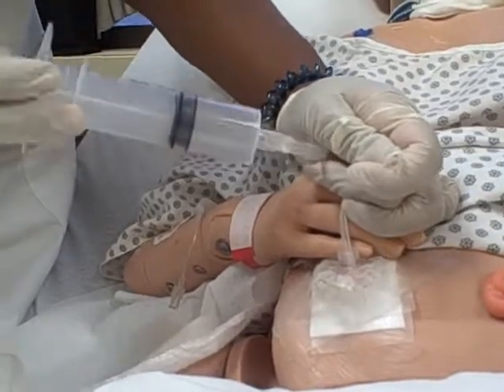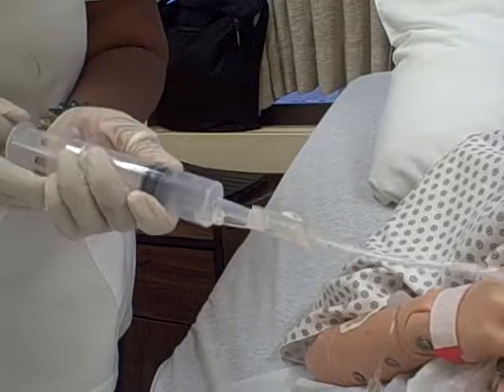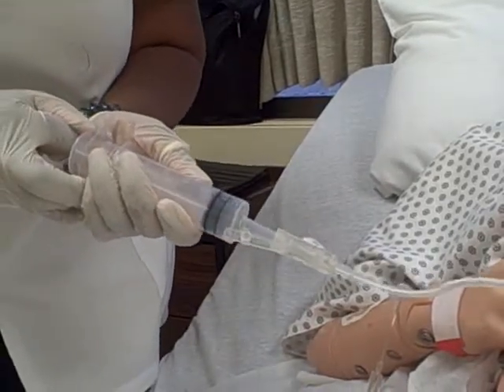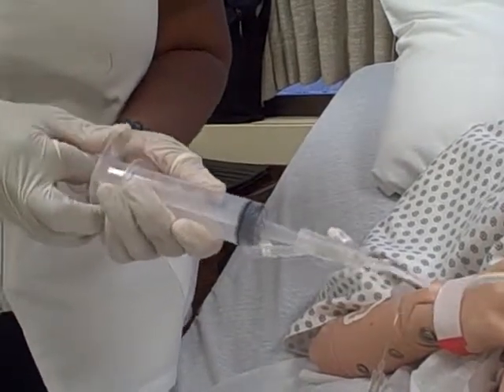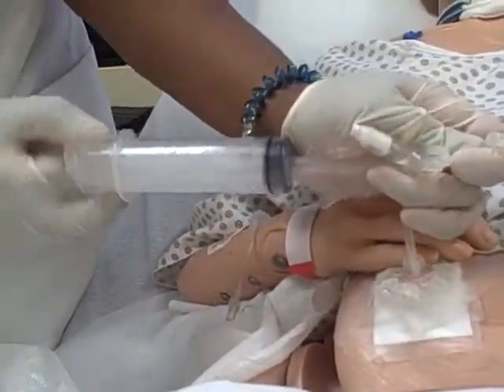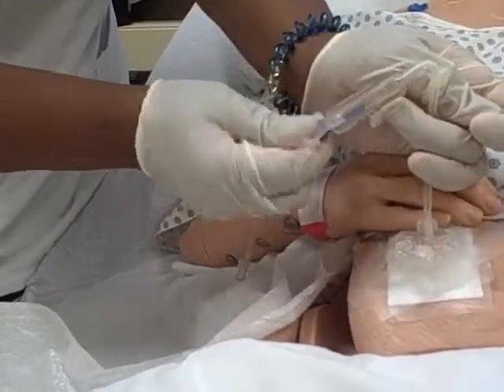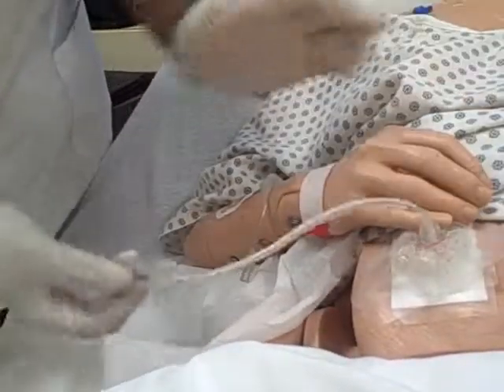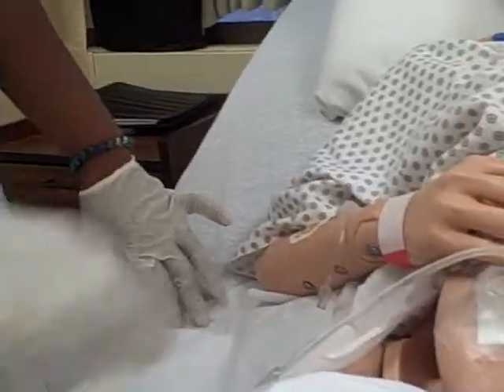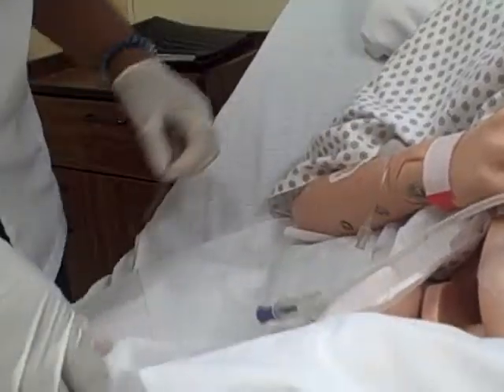And I want to unkink and irrigate the tube. Going to kink, remove the plunger. Reinstill the tube, unkink. Then I want to turn on the feeding tube, the feeding pump.